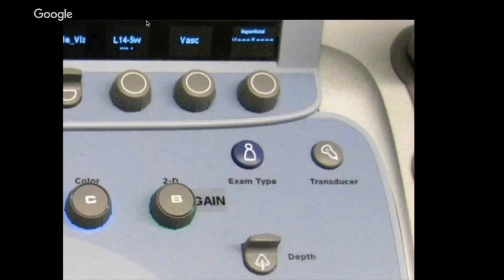If I was teaching the very basics of driving, I would teach someone how to turn on the car, and I would teach you how to turn on the machine. I'd teach you to make it go forward and to use the steering wheel. And I think the equivalent things in using an ultrasound machine are, yes, turning it on, but then gain and depth are probably the two biggest things. And then switching between different probes and applications, which is like switching gears.